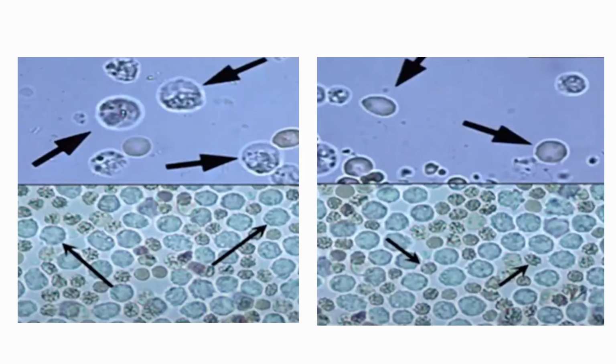So we see here a microphotograph of a urinary sediment showing the WBCs. These are the larger cells with granulated cytoplasm, while the rounded enucleated smaller cellular structures are representative of the red cells in the urine.